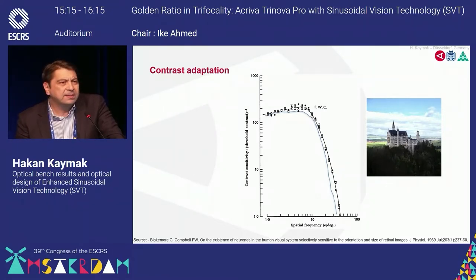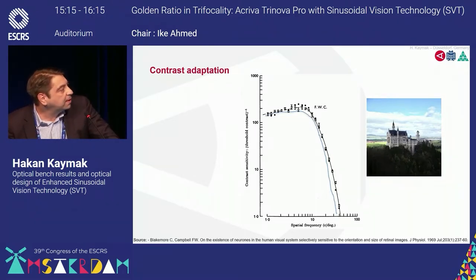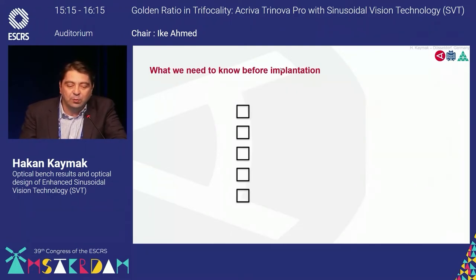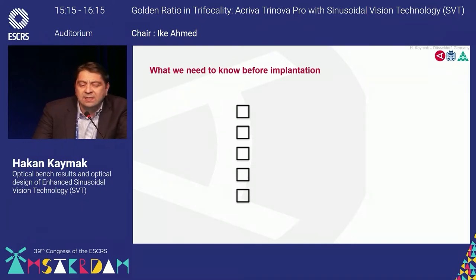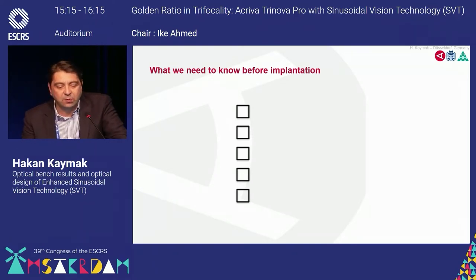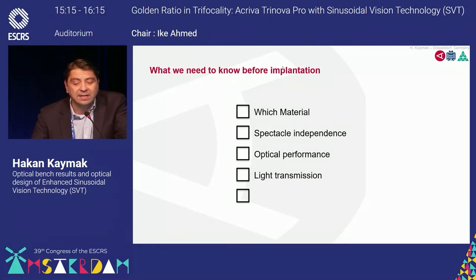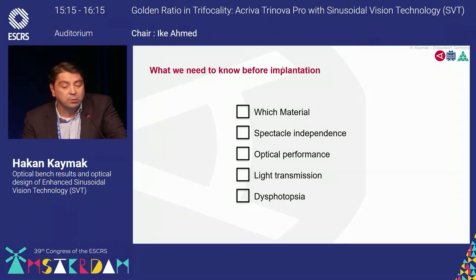I think it's interesting that we see this contrast adaptation also in eyes with macular disorders, and I think it's important for you two guys that glaucoma patients also have this contrast sensitivity adaptation profile. So what we need before implantation of multifocal IOLs, I think we should know: which material we have, what about the spectacle independence, what about the optical performance, what about the light transmission, and what about dysphotopsia.